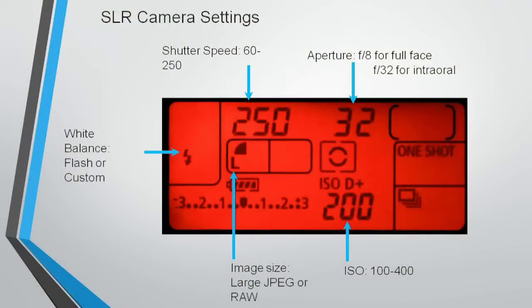I always tell doctors about camera settings, not as detailed as you, Dennis. I'm not a professional like you. I can take some okay photos. But when I teach doctors about settings on cameras who absolutely have no idea and just bought the camera, I just send them a photo here, you can see on the screen right now, and I tell them use these settings and you will take a good photo just by changing, for example, the shutter speed.